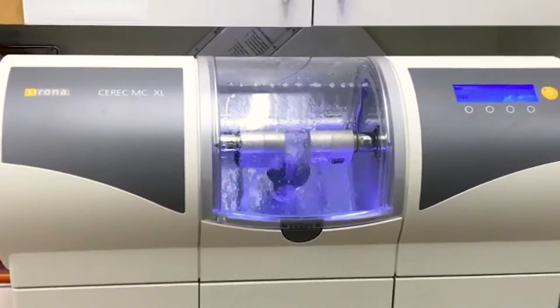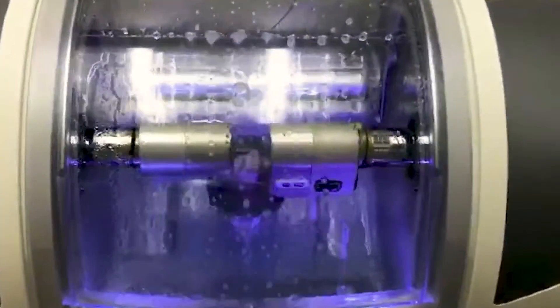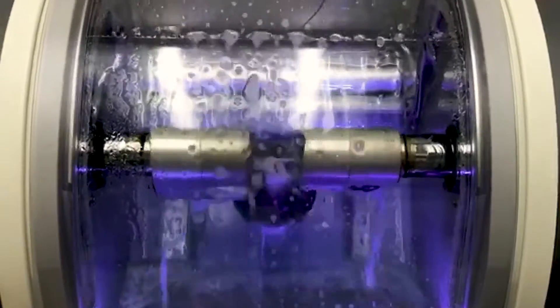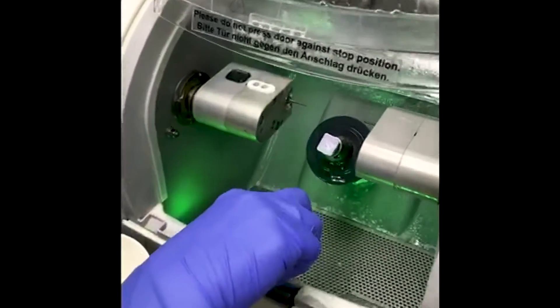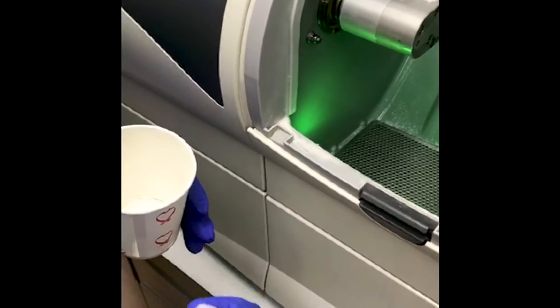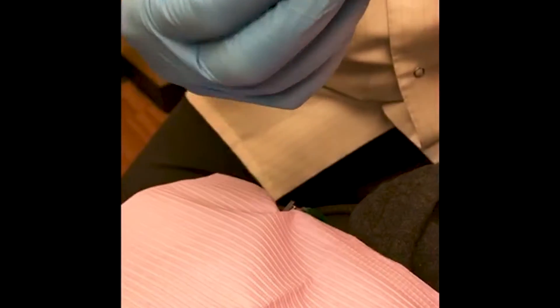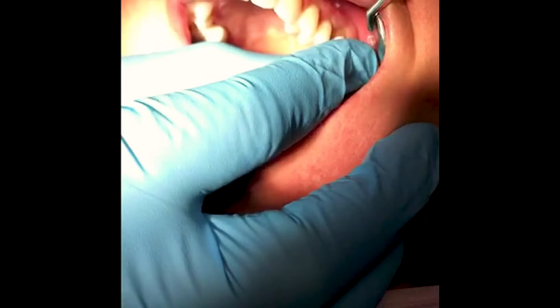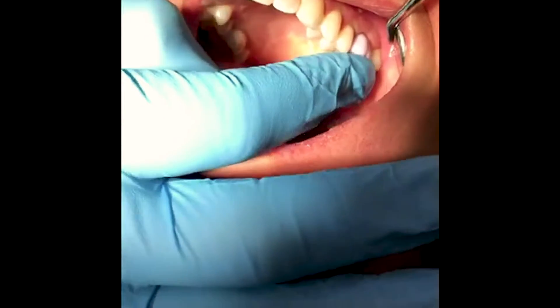The milling machine will exactly duplicate what we've just designed out of a block of unbaked porcelain. Here you can see the machine carving the crown out, and after about five or six minutes we have a crown. It has a purplish hue before it goes in the oven, but first we'll try it in the mouth and make any necessary adjustments.